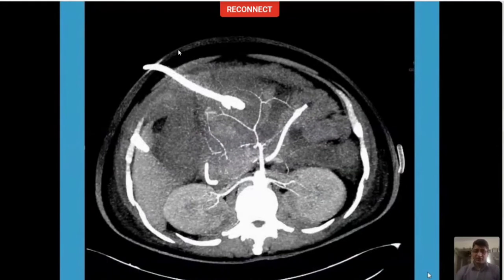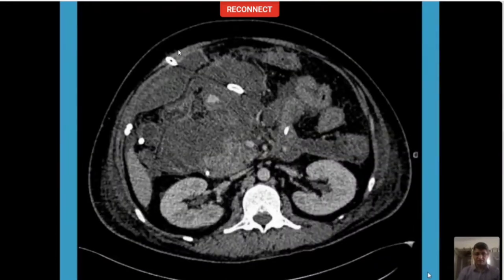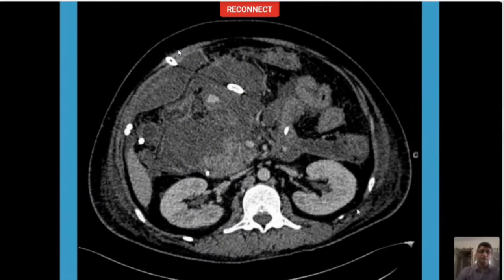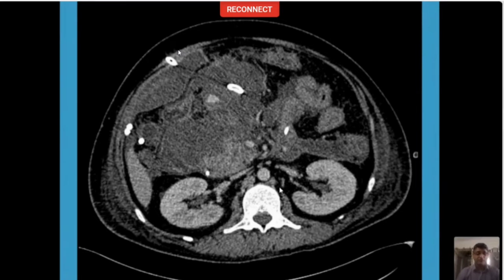So we come to GI bleed — back to our topic. In your exam you might get some image like this. You will see a lot of areas of collection, there's one catheter going inside, the pancreas may not look good. This is a MIP image, so you can easily come to a diagnosis of pancreatitis. But once you have come to this diagnosis, if you fail to notice this area of contrast extravasation, it's a sin. This is a critical alert which you have to tell to the clinicians or to the interventional radiologist so that immediate action can be taken and the patient's life can be saved. So whenever you see cases of pancreatitis, you must try and identify if there is any type of arterial extravasation.